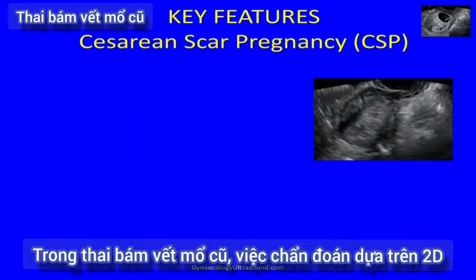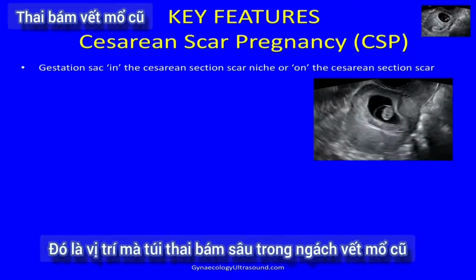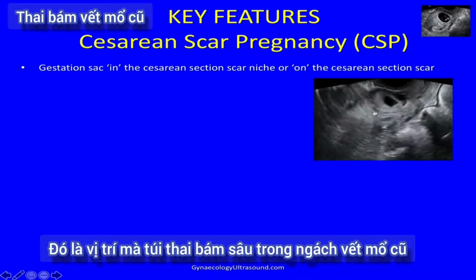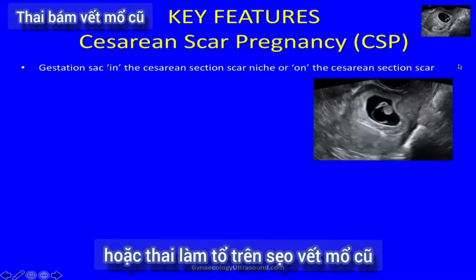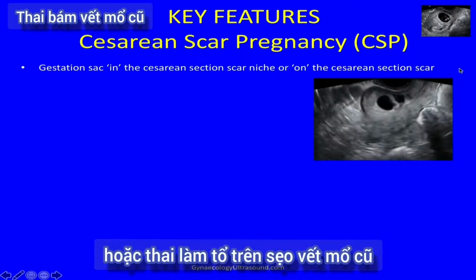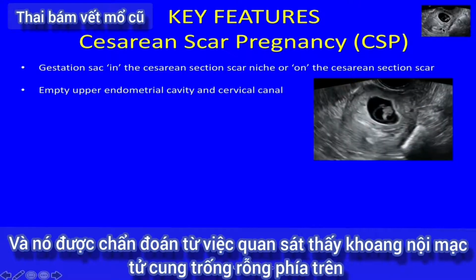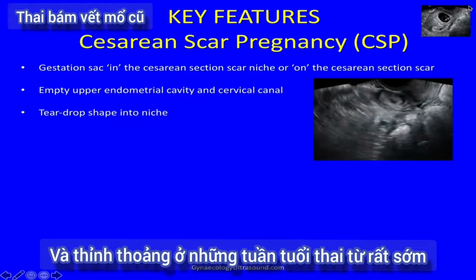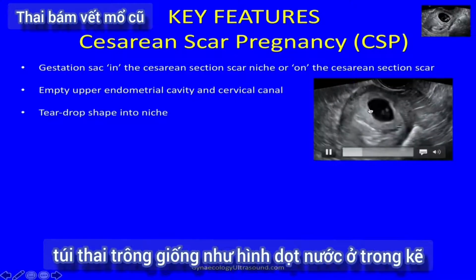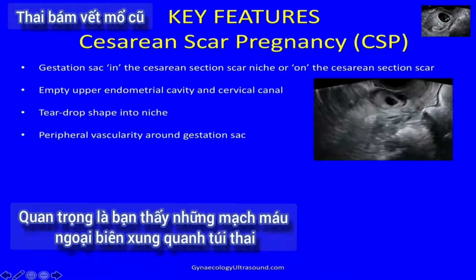In caesarean scar pregnancies, the diagnosis is made on 2D, and it's where the gestation sac is deeply embedded within the caesarean niche, you can see that just there, or implanted on top of a caesarean section scar. And it's diagnosed by seeing an upper empty endometrial cavity, an empty cervical canal, and sometimes at a much earlier gestation, the gestation sac looks like a teardrop shaped into the niche.